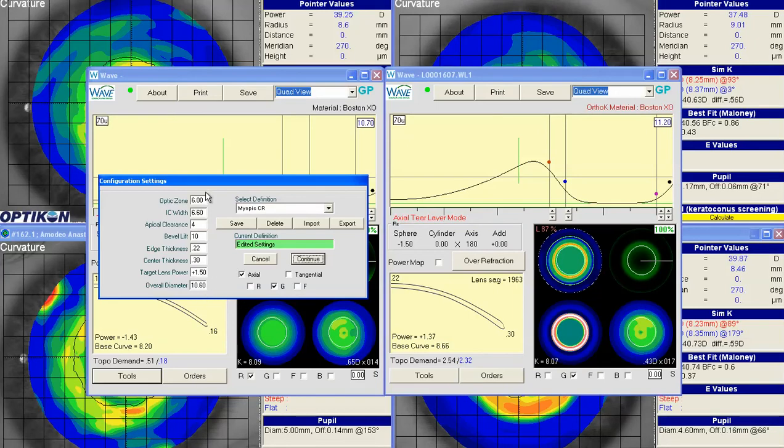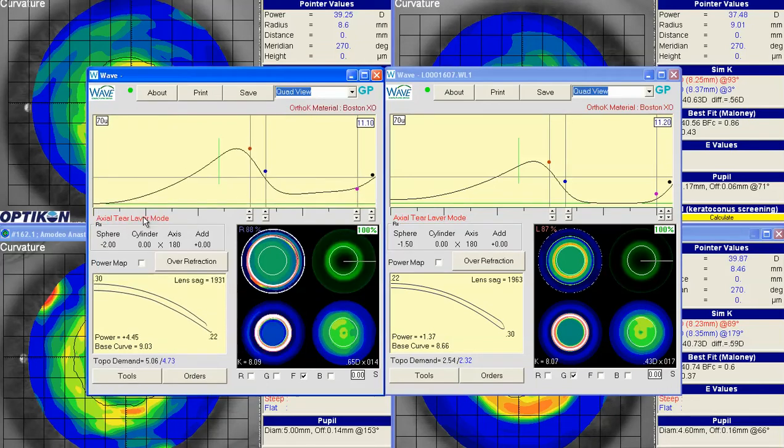Except our target lens power in this case will be around 2.5. And then you can also select your freeform if you want to. And we're going to go with the original diameter of 11.1. So if we hit continue.